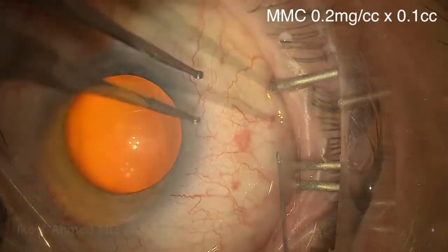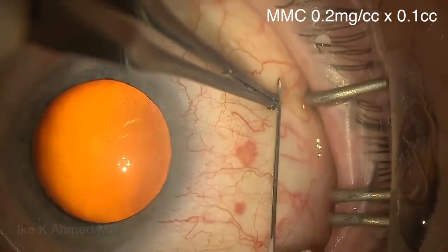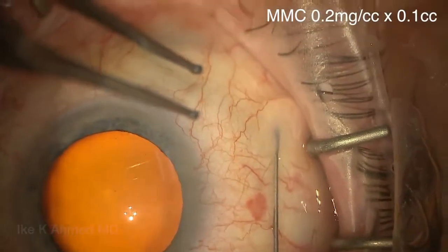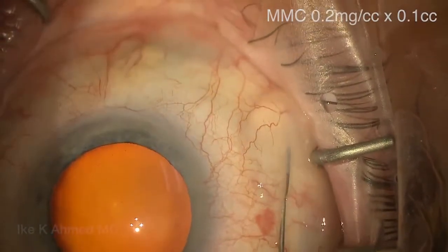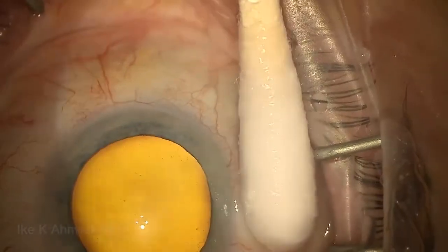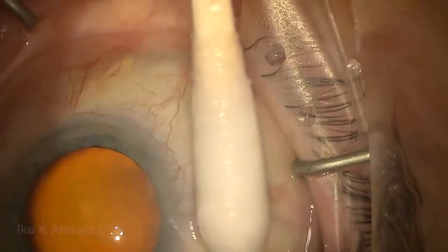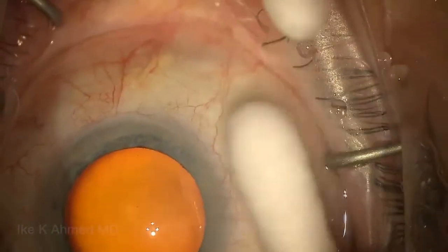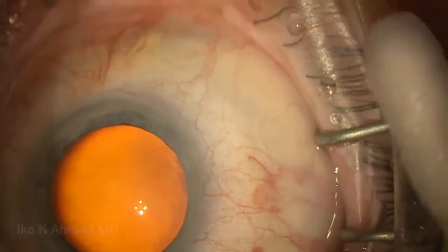This is a combined phaco/Zen case. We'll start with the mitomycin injection on a 30-gauge needle, placed 6 to 8 millimeters back from the limbus, injecting an intratenon dose of mitomycin — a small dose of 0.1 cc at 0.2 milligrams per cc concentration — and having the patient look down while rotating a moistened q-tip to keep the mitomycin back away from the limbus.